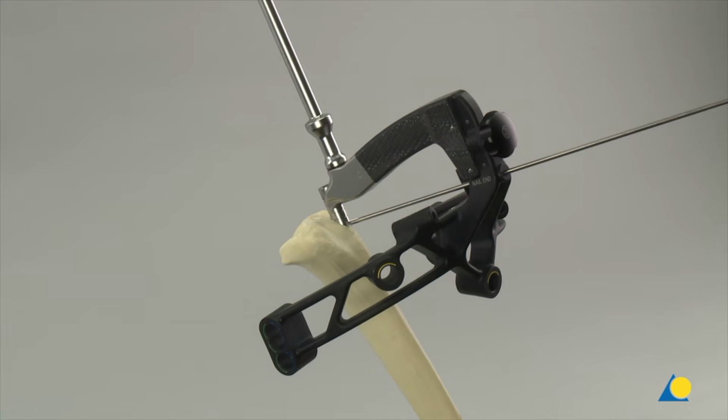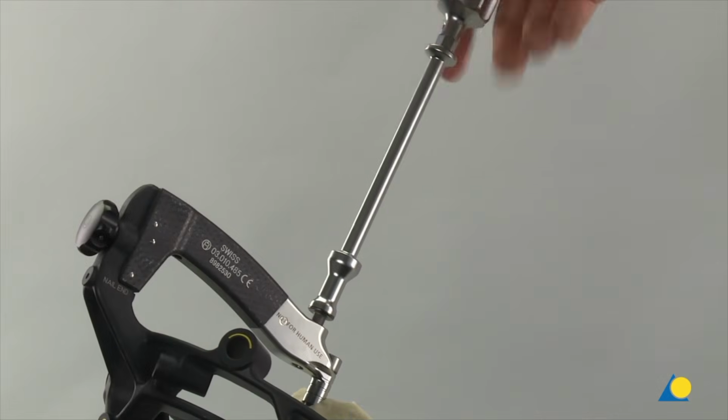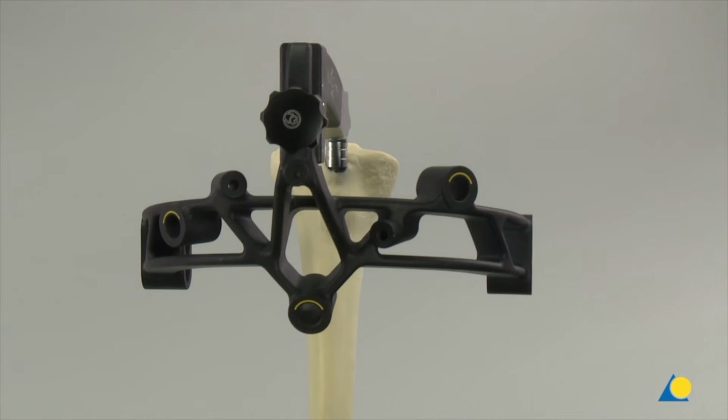The guide wire is removed from the aiming arm. The driving cap is unthreaded from the insertion handle. The next step is to lock the nail either distally or proximally. If the fracture was distracted, distal locking would be performed first and the aiming arm would now be removed. In this exercise, as there is no fracture, distal locking will be described but not performed, so the aiming arm remains attached for proximal locking.